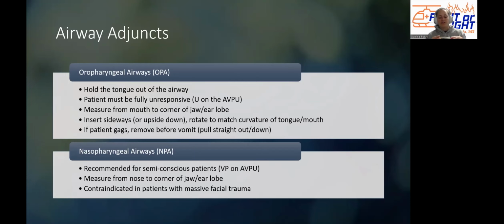If it's just barely too long, you can clip the end off. And then this is going to go into the nose. I like to put it in upside down and twist as you go. Now, if you start reading different opinions, you'll see people saying bevel towards the septum or bevel away from the septum. I went on an adventure trying to figure out what this was all about, if it really mattered.